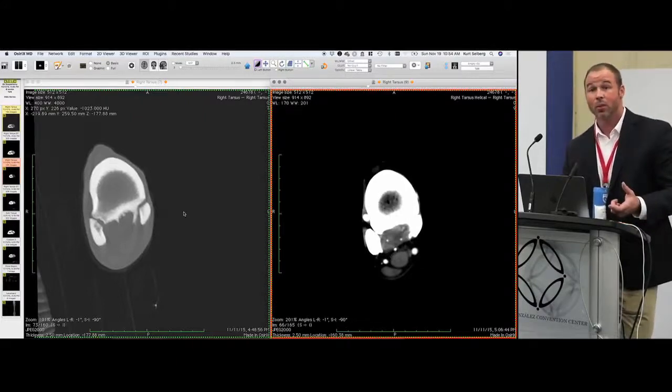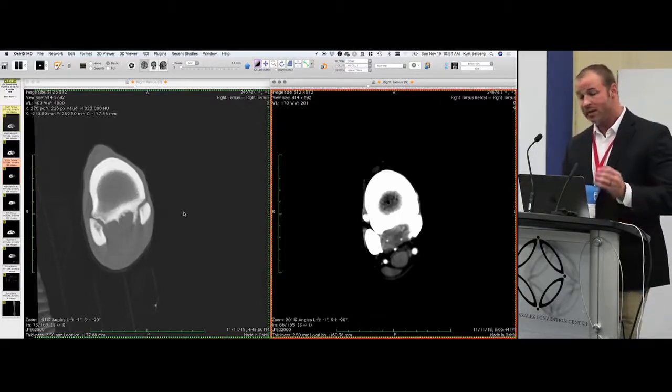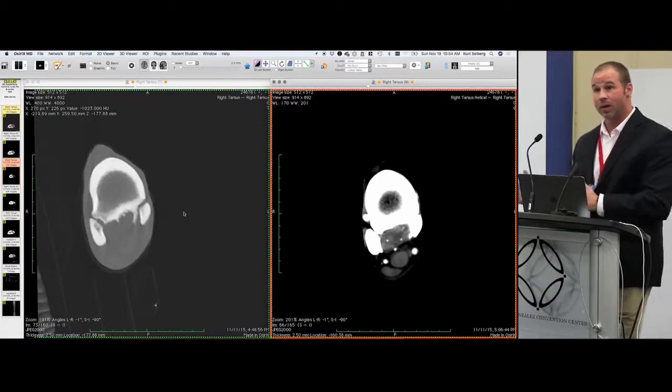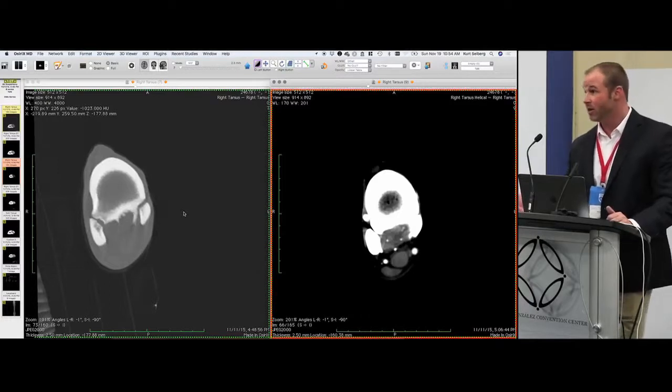So this is an important area, especially in areas that, let's say, are outside of a comfort level for certain people, depending on what happens in their practice. The CT will help out. And now you get the CT, you get to go back and look at ultrasound too and compare those. This modality will up your game in terms of looking at areas of pathologic change in a variety of areas using ultrasound and CT.